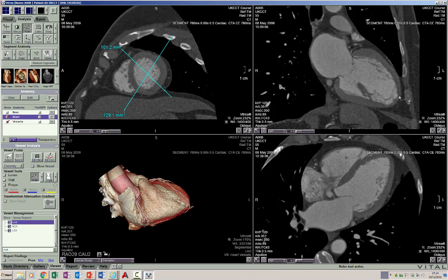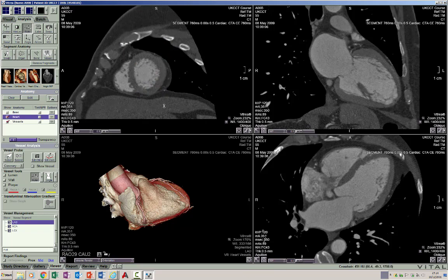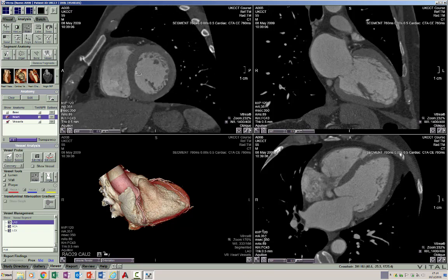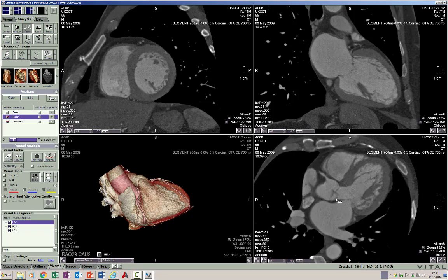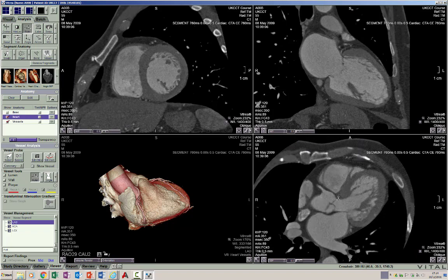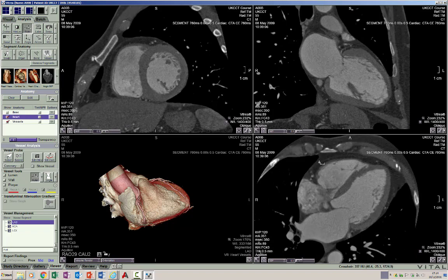Let us look at the pericardium on the workstation. You can see very clearly this thin structure surrounding the heart, particularly on the anterior and superior aspects. This is the pericardium containing two layers within it, as explained in the first session. The layer of fat lying between the pericardium and the myocardium is the epicardial layer of fat, and the fat that lies outside the pericardium is the pericardial layer of fat.